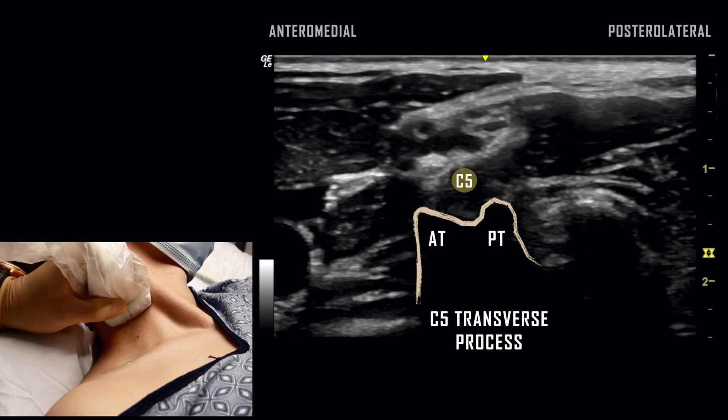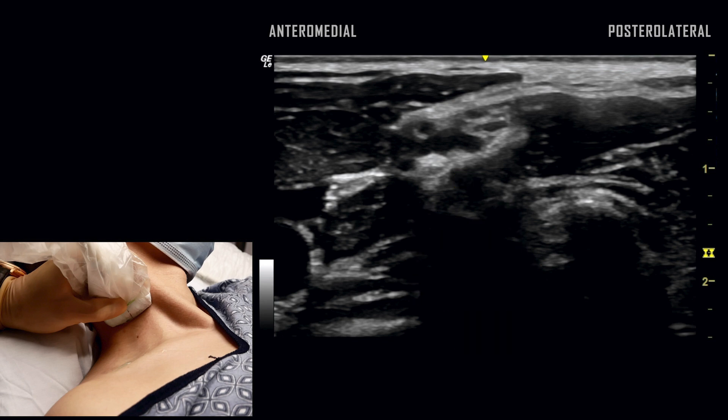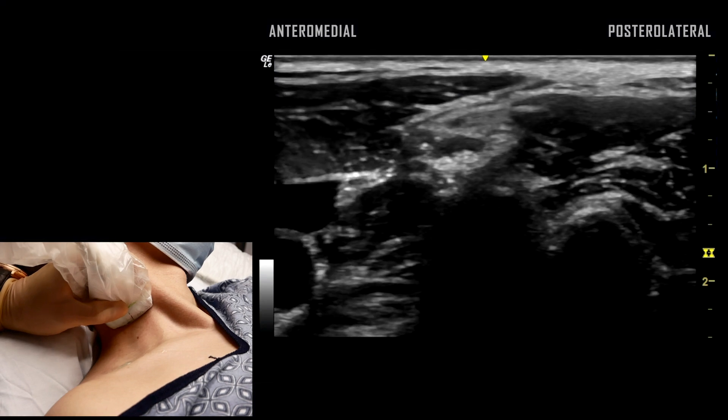Tracing the nerve roots in this manner may be helpful in identifying structures of the brachial plexus seen with the supraclavicular and interscalene approaches.